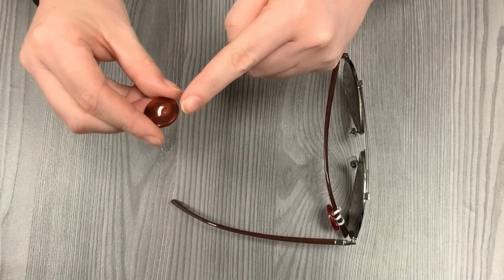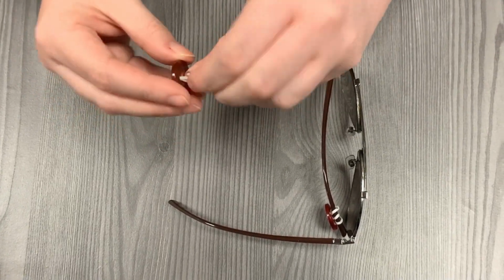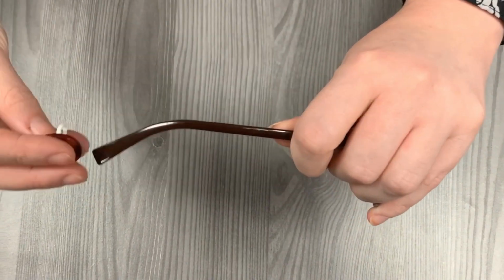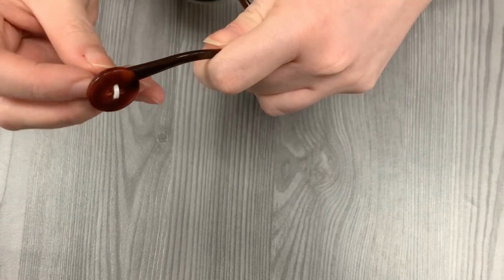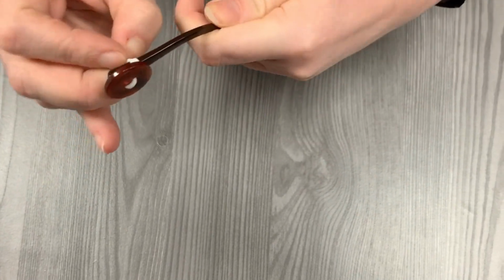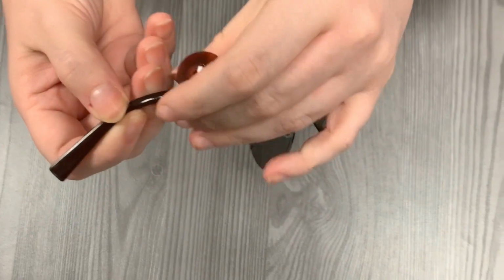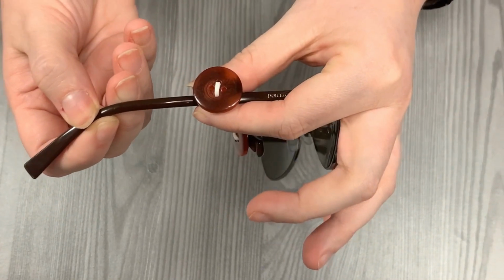So what you're going to do is, with the button, you're going to have the two elastic bands. You're going to take the arm of your glasses and thread it through, so that it's nice and snug, just like that.